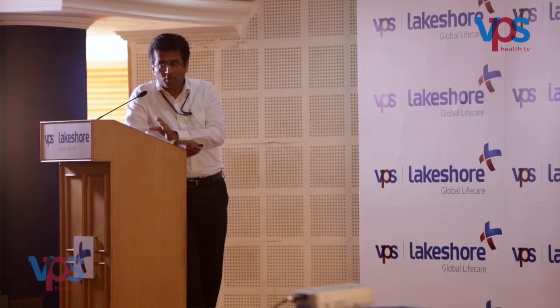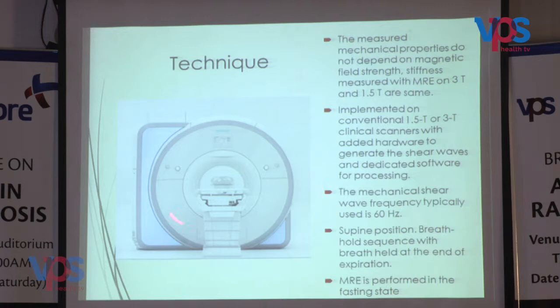It can be used at 1.5 Tesla or 3 Tesla. That does not really make a difference. This is our state-of-the-art 3 Tesla MR Skyra, and the main thing is that the frequency has to be the same. If the frequency is increased, your value is going to change. So the frequency is standardized at 60 Hz, and the patient has to be in the supine position, and ideally you take it in end expiration. If the patient cannot tolerate breath holding like that, you take it in deep inspiration.